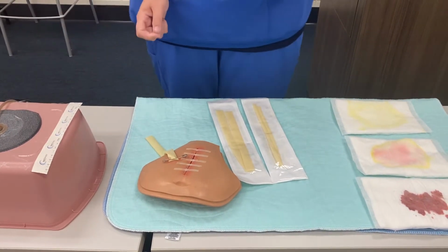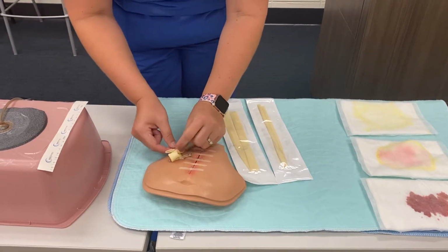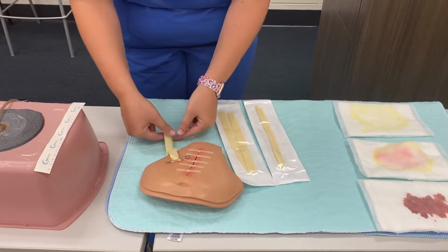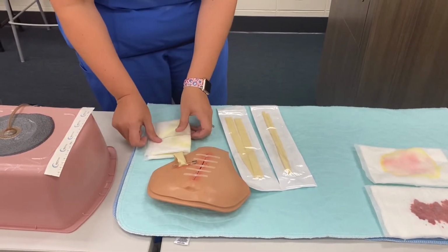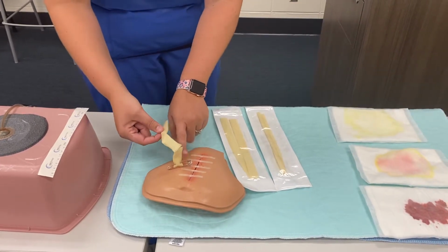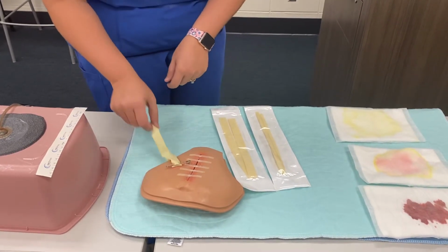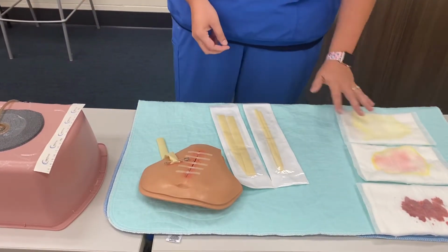So you have to be very mindful. You're going to have this Penrose drain, and it's going to have just gauze at the end that is absorbing anything coming out, okay? So you have to be mindful that it's not dripping on the skin and going to cause skin breakdown, and you just are going to go in and change those dressings or reinforce those dressings, okay?